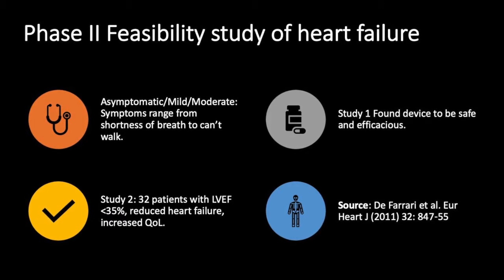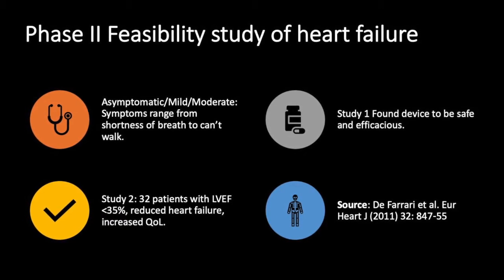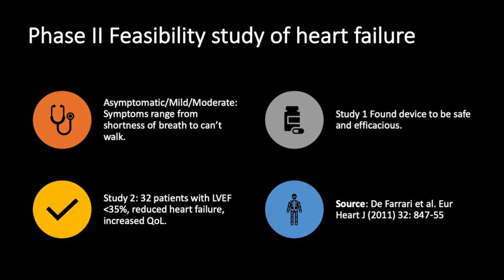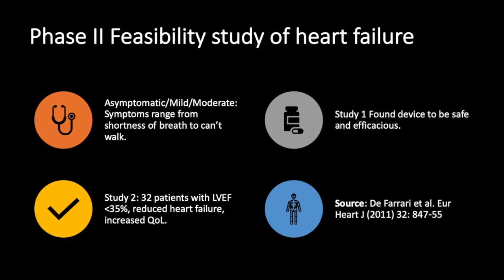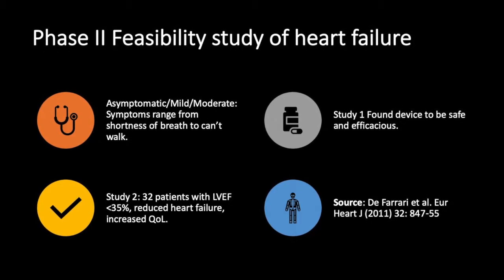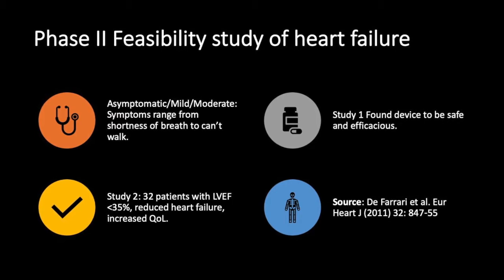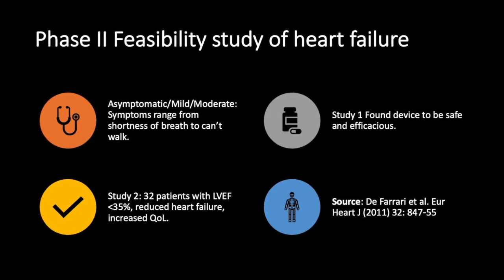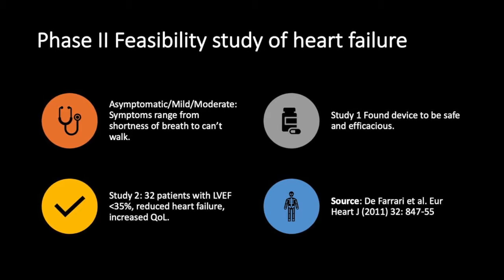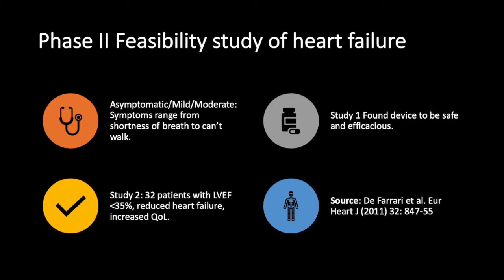So these devices that stimulated the vagus nerve were found to not be deadly. And study 2 found that 32 patients with LVEF of less than 35% had reduced heart failure and increased quality of life. LVEF stands for left ventricular ejection fraction, and this is basically the amount of blood that exits the left ventricle of the heart.